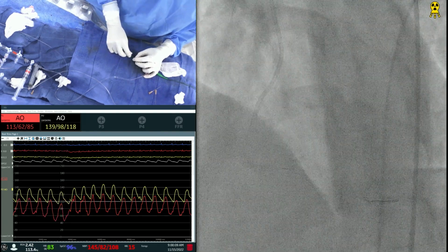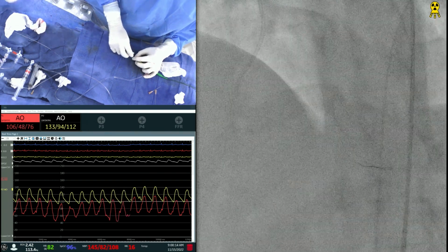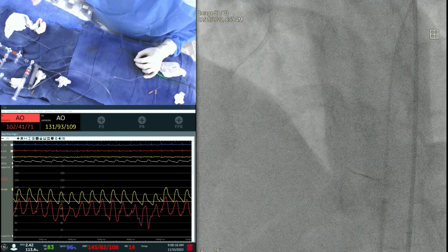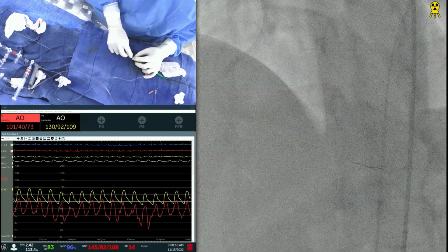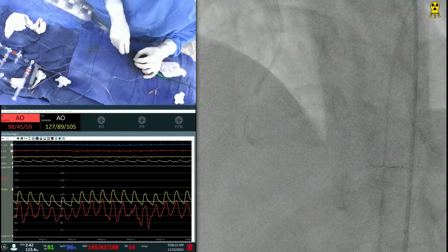Most important is how we handle the CTO bifurcation. Yeah, absolutely. That needs a final touch. When you finish your lecture, I will give you that. Okay. So do you want to wait till you cross or what do you want to do?